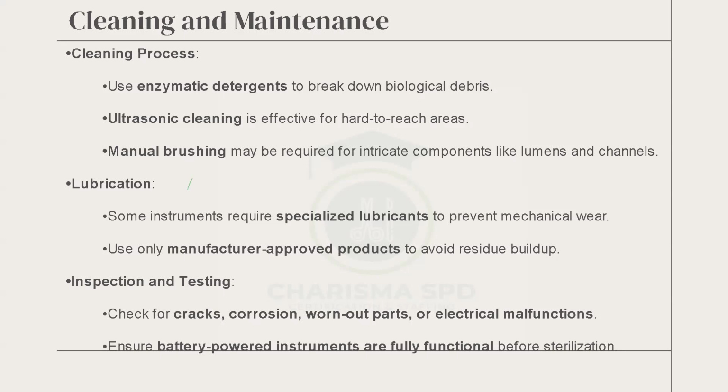Ensure battery powered instruments are fully functional before sterilization. We'll come to see that some use battery to power the instrument, so we have to check to make sure that they are functioning. You load the battery on it and then pull the trigger to see if you can hear the spin or the noise that it's supposed to make.